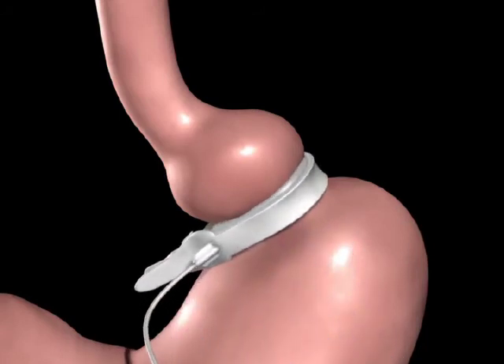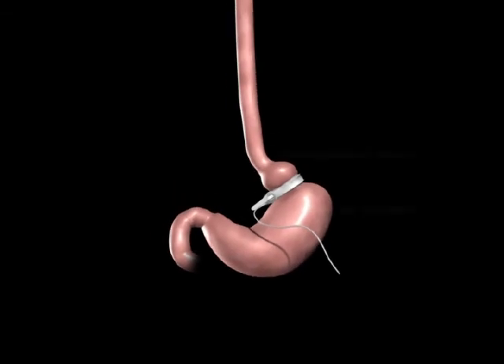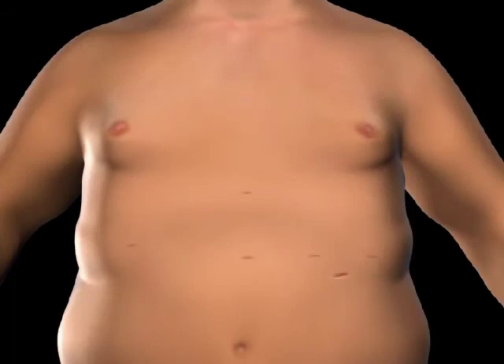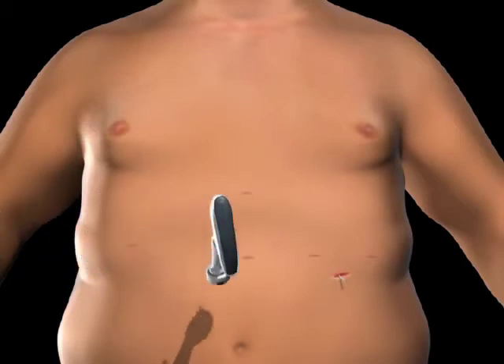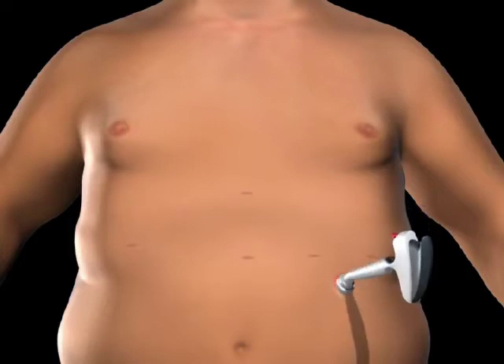A tube attached to the band will be connected to the injection port. The port is used to adjust the band tightness after surgery. An incision is made on the upper abdomen to insert the injection port beneath the skin. The tube is secured using the locking connector on the port, and the injection port and tube are placed beneath the skin.